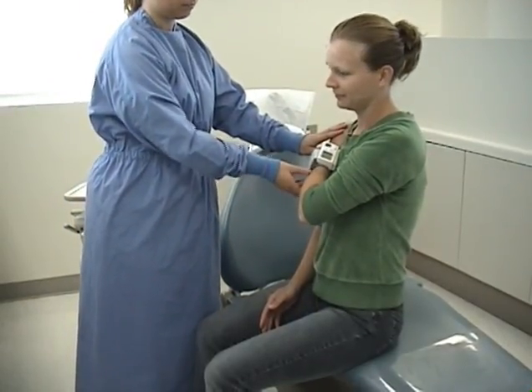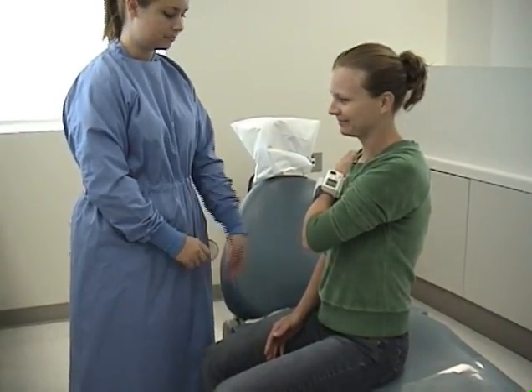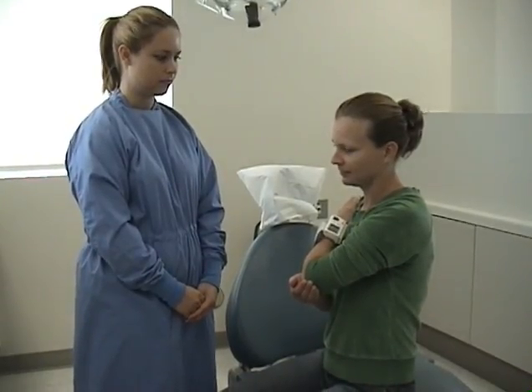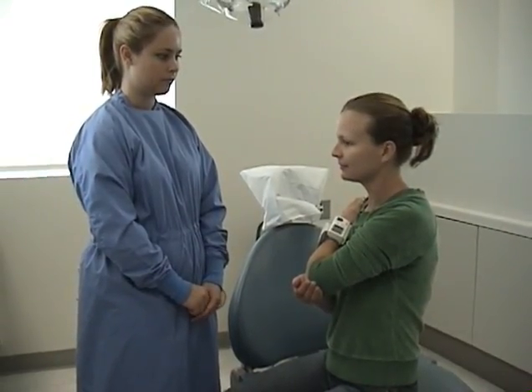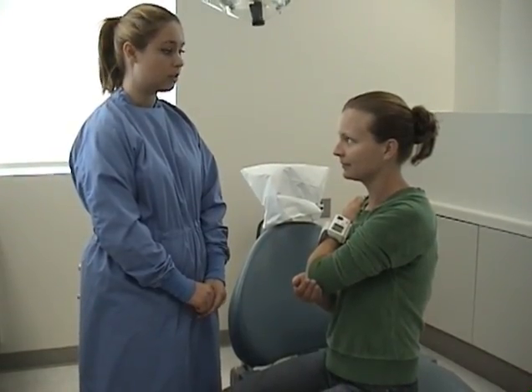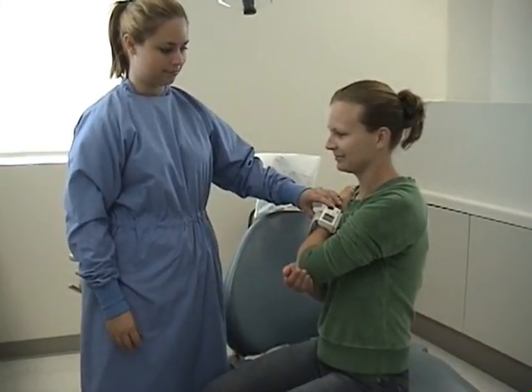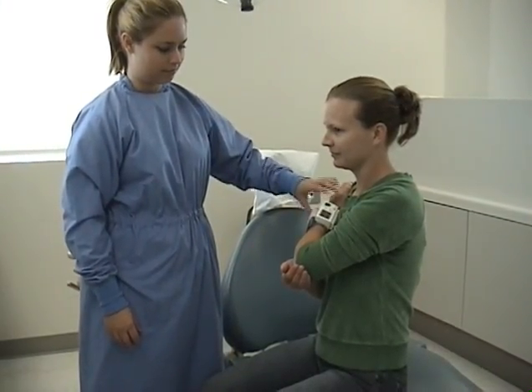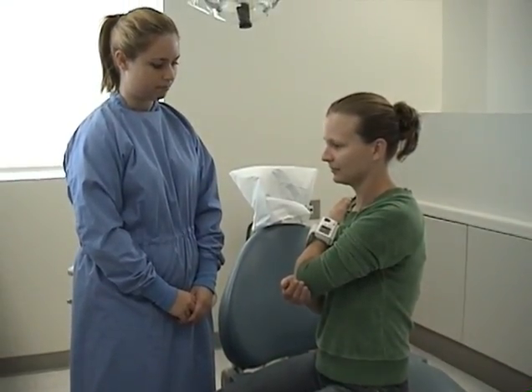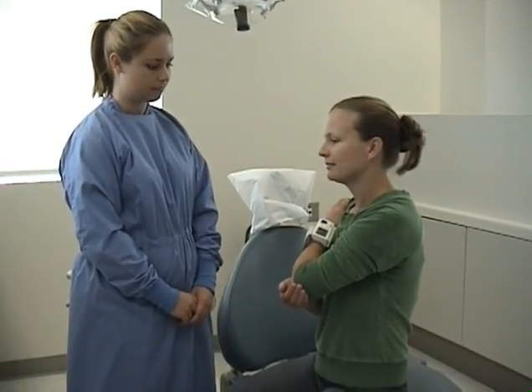Position the cuff at the same level as the patient's heart. Direct the patient to support this wrist with their other hand. Direct the patient to stay still by telling them no talking or moving while you're taking their blood pressure. Push the start-stop button. When the blood pressure reading is complete, the display lights will indicate so.